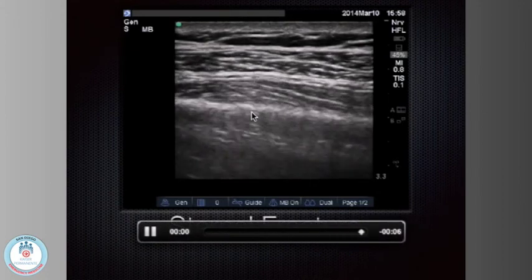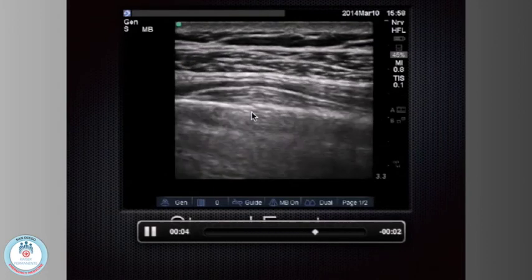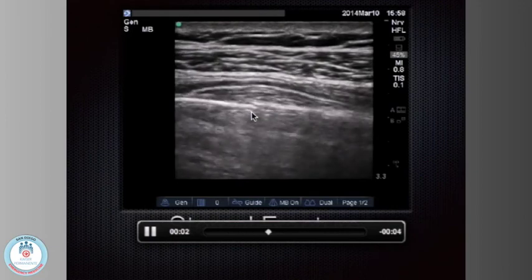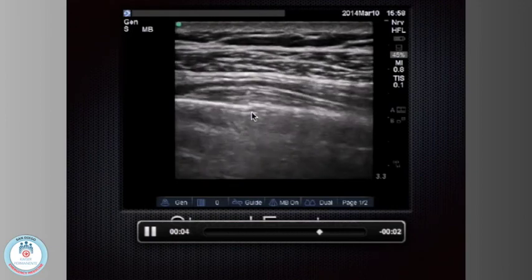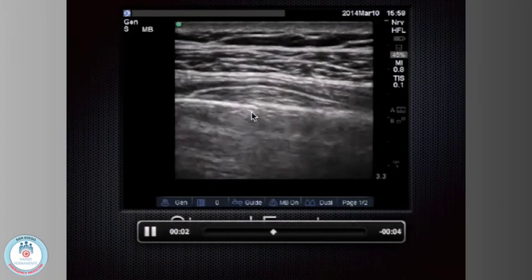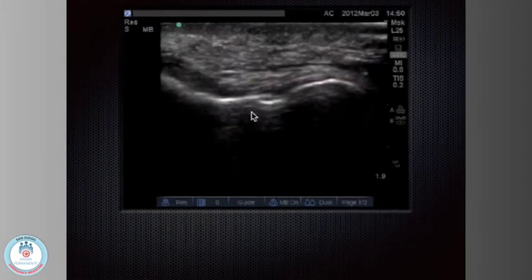Now, it's important to differentiate a sternal fracture from the manubrium. So I always start right on the manubrium because it looks kind of similar. It's the joint of the sternum. You start up in the manubrium, and you'll see the two bones come together, and then you just slide down. You kind of fan side to side as you're going down the sternum. Whenever somebody has blunt trauma to their sternum, you'll start to see the sternal fractures. X-ray misses them all the time. They get picked up on CT.